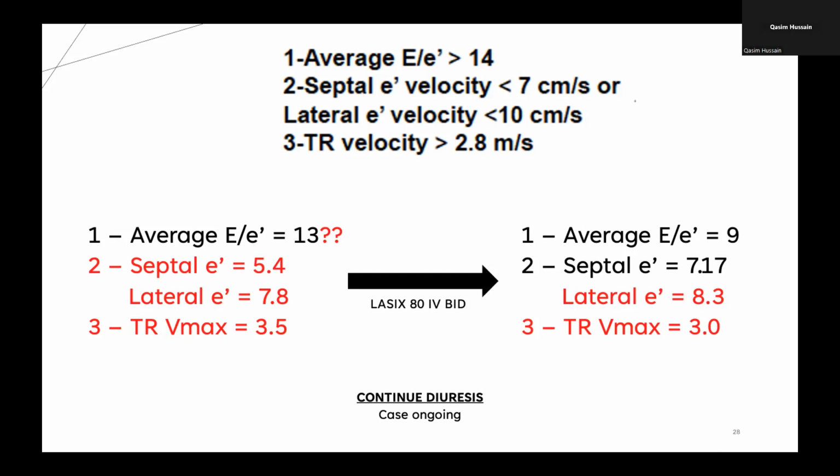But when you're just following these patients with serial assessments, it's great to just focus on what you're looking for, get those numbers, and then see if you're moving in the right direction or whether you need to increase diuresis, change your strategy, or what else you need to do clinically. So that's where the point of care becomes really useful, because you can't get echoes this often or this frequent, right? So now you can just follow your patients hemodynamically, and you don't have to struggle to look for the JVP or other physical exam maneuvers, which you could certainly still do, because at the end of the day, this is just another data point in your entire clinical picture. So I thought this was a phenomenal example. I'm going to rescan her, and then we'll see how she does over the next couple of days.